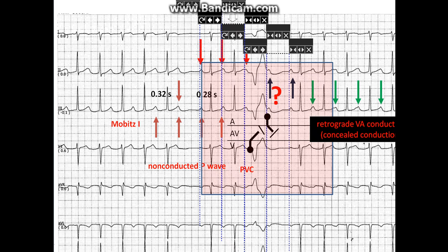The concealed conduction manifested as a block — a non-conducted P wave. This VA conduction made the AV node refractory to the incoming sinus P wave, thus the sinus P wave was blocked. This is better appreciated with the ladder diagram. The PVC made the strip a little complicated, but the whole arrhythmia is just Mobitz 1.